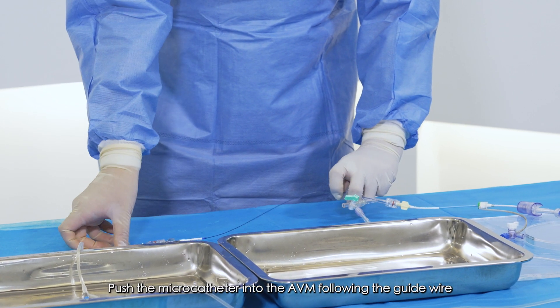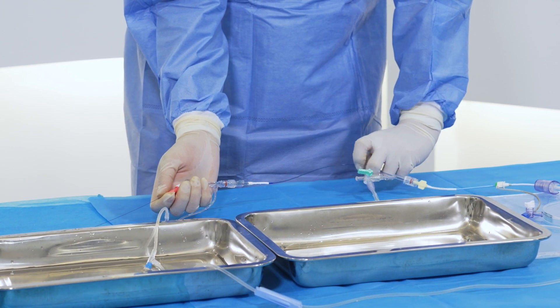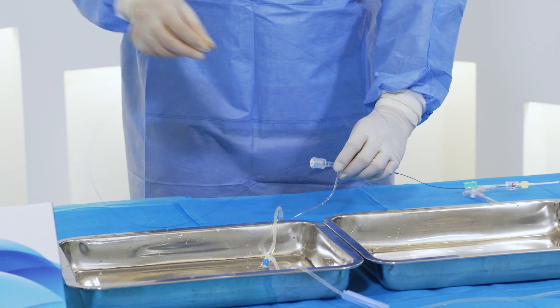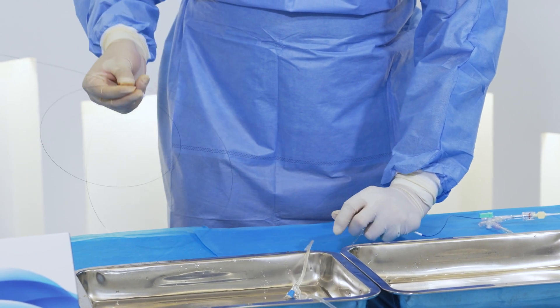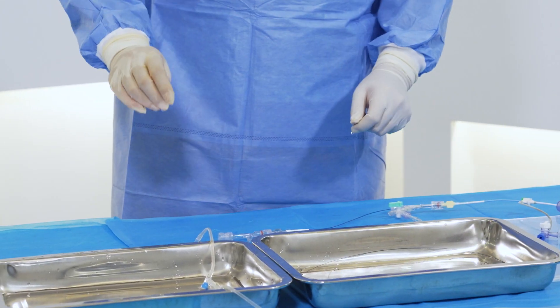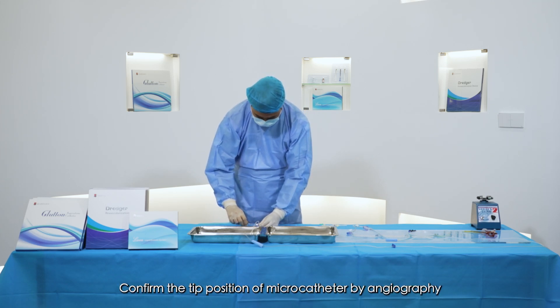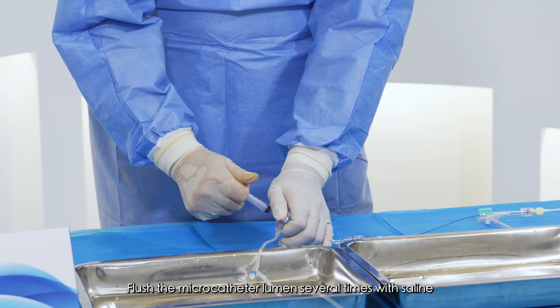Push the microcatheter into the AVM following the guide wire. Then remove the micro guide wire. Confirm the tip position of the microcatheter by angiography, and flush the microcatheter lumen several times with saline.